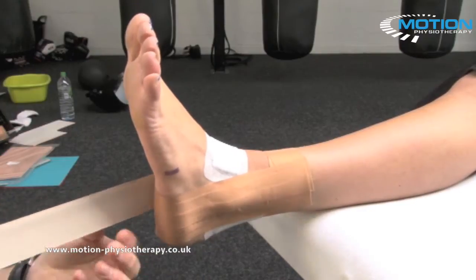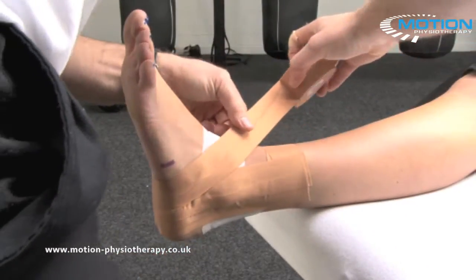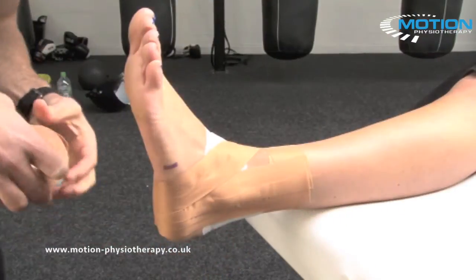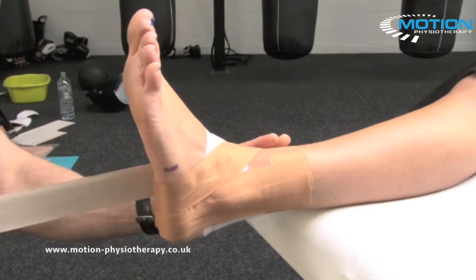The figure of six can be applied to either side of the joint. This figure of six crosses over the front of the joint line, rocks around to the sides to ensure that there are no creases, and slowly working forwards.